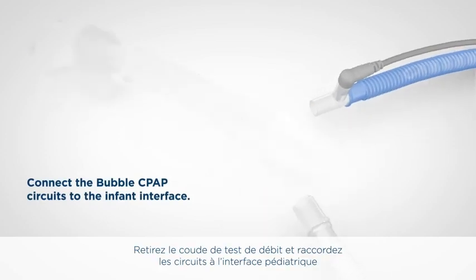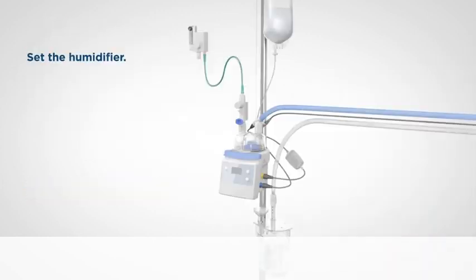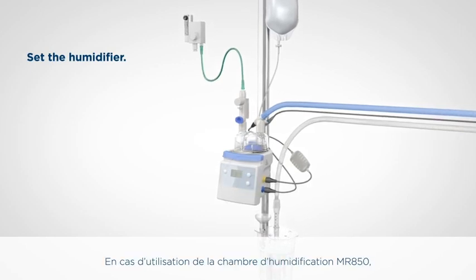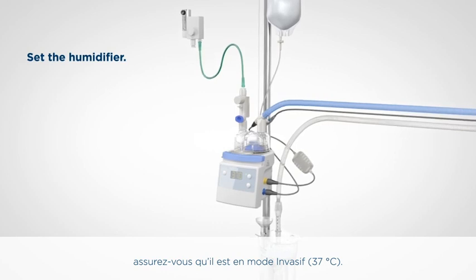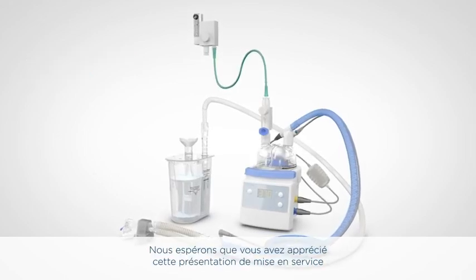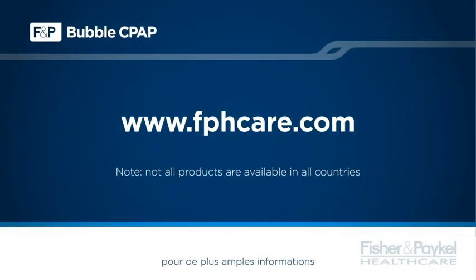Remove the flow test elbow and connect the circuits to the infant interface using the instructions provided with the interface. Ensure that the system is running before connecting to the infant. We hope you've enjoyed this in-service presentation on the Fisher & Paykel Healthcare Bubble CPAP Delivery System. Please contact your local representative for further information about these or any other Fisher & Paykel Healthcare products or therapies, or visit www.fphcare.com.